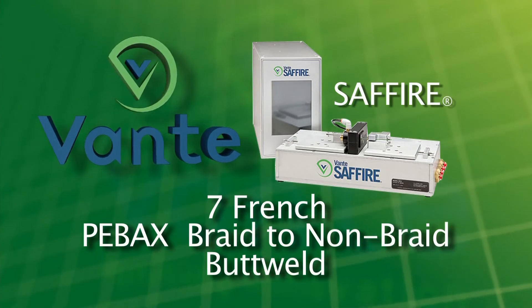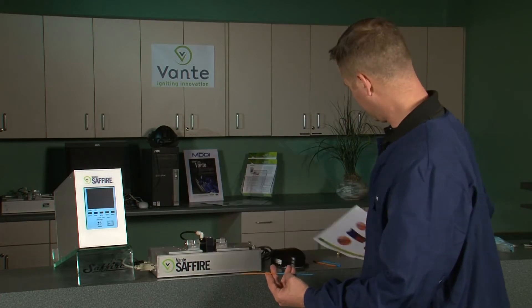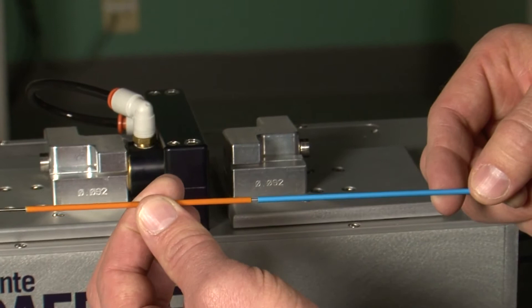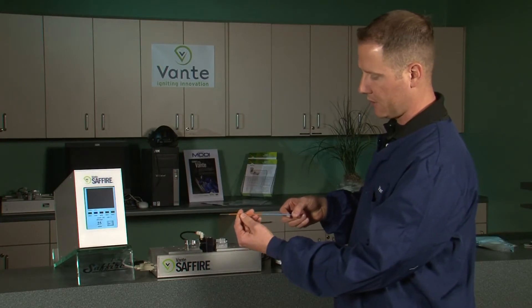The application we're going to be demonstrating is a seven French Pebax braid to non-braid butt weld. What I have here is an orange non-braid Pebax and a blue braided Pebax. I have them already pre-loaded onto a mandrel.